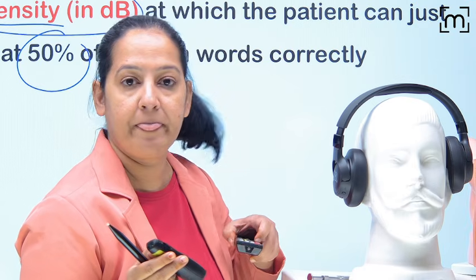So I will play 100 words. Maybe the patient is normal and repeats all 100 words correctly. Maybe the patient repeats 70% of words correctly, 60%, 50%, but 50% is the threshold. The intensity, in decibels, at which the patient repeats at least 50% of the words played here, out of the 100 words, that is known as SRT, speech recognition threshold. Got it? So this is how we perform the SRT.